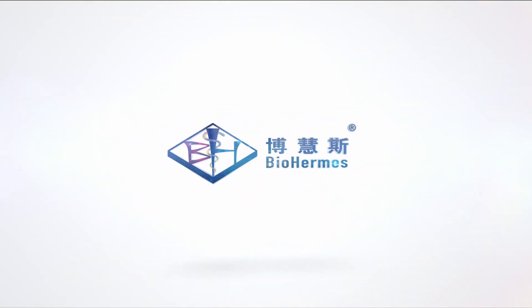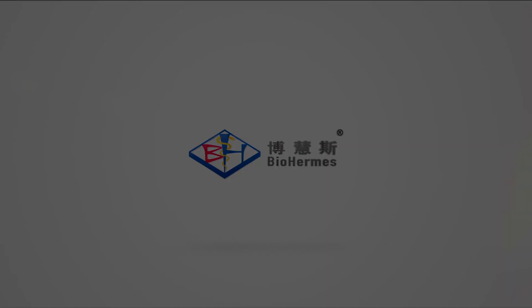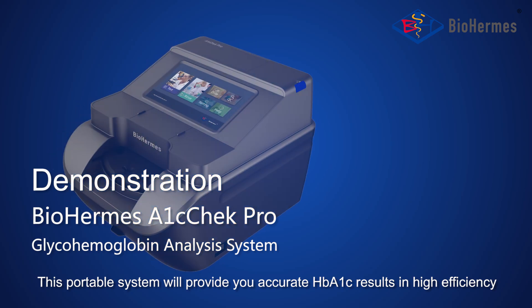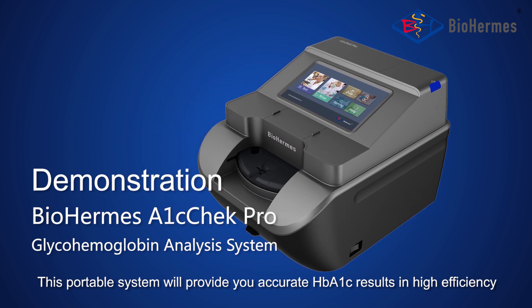Welcome to the demonstration of BioHermit's A1C Check Pro Glyco-Hemoglobin Analysis System. This portable system will provide you accurate HbA1c results in high efficiency.